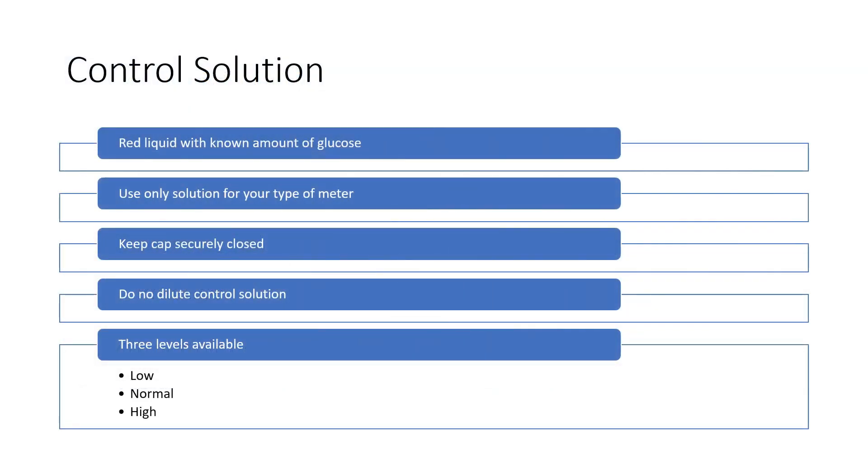A little bit more about Control Solution: the Freestyle Control Solution is a red liquid that contains a known amount of glucose. We know what that reading should come in as. You want to be certain to use the one appropriate for your type of meter, as Freestyle does make different control solutions. Always keep the cap securely closed when not in use — you don't want to dilute the Control Solution. There are three levels available: low, normal, and high. In the following demonstration, I will use the normal control solution.